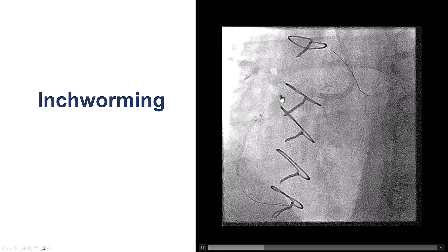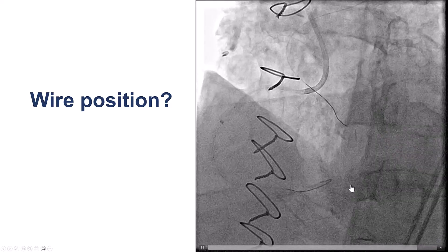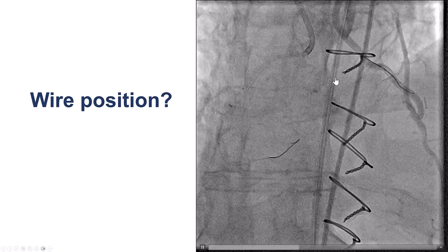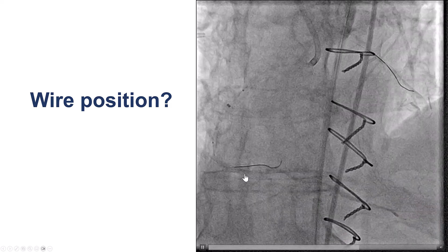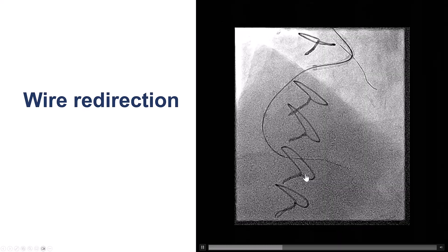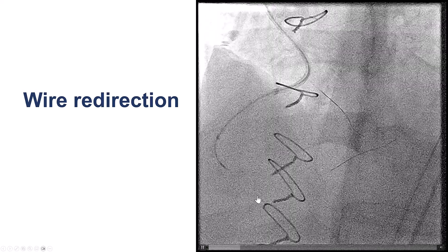We were able to get the guide extension — a 6-French guide extension — further down into the vessel. We then advanced the knuckle wire further down, hoping it would go along the course of the PDA, but the wire seemed to be going in a different direction. We tried different projections to understand where the wire was going, and did not think it was going outside the vessel. Retrospectively, there may have been some tenting of the vessel from the touchdown of the previous bypass graft. We tried to redirect with various guidewires and were able to get the knuckle in a different location, but still not quite where we wanted.